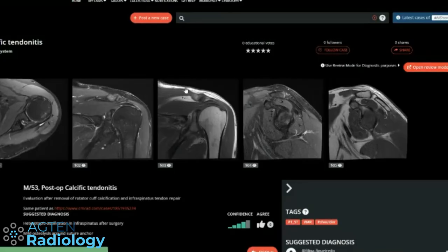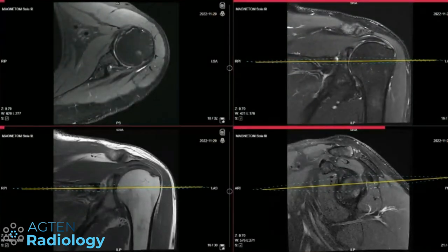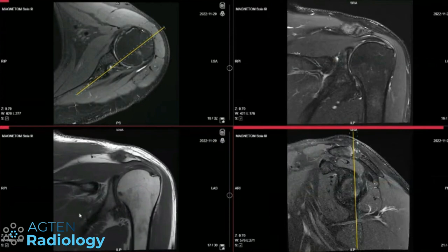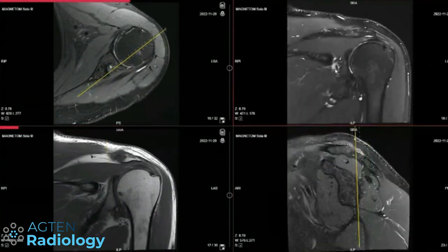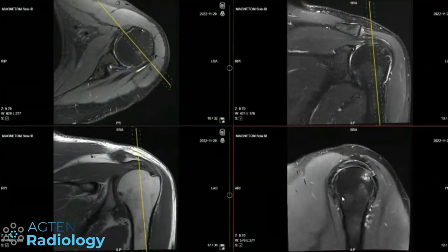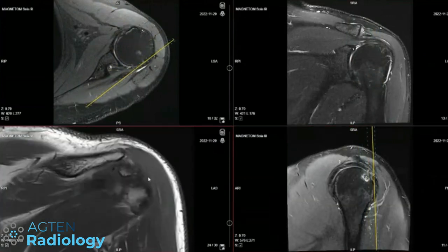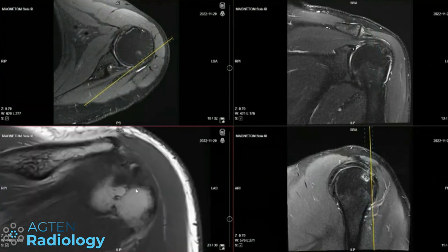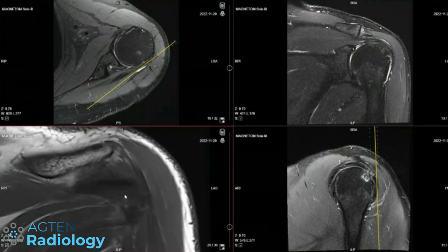The other case is the pre-op study. So jumping back to this one — they had to fix the tendon with this screw here. The time delay since surgery was about six months, not longer than a year. We have this defect here, and one differential would be some form of heterotopic ossification, although that's not very common in tendons.